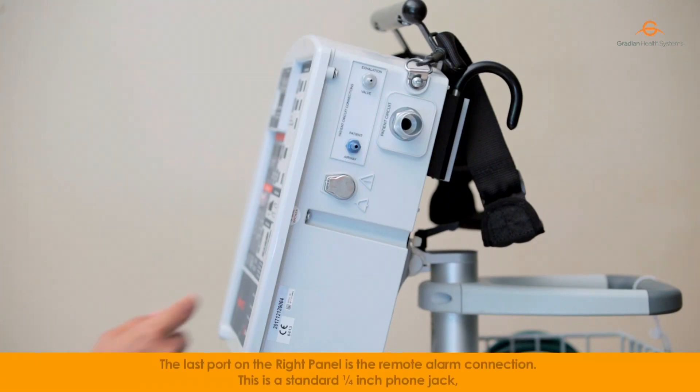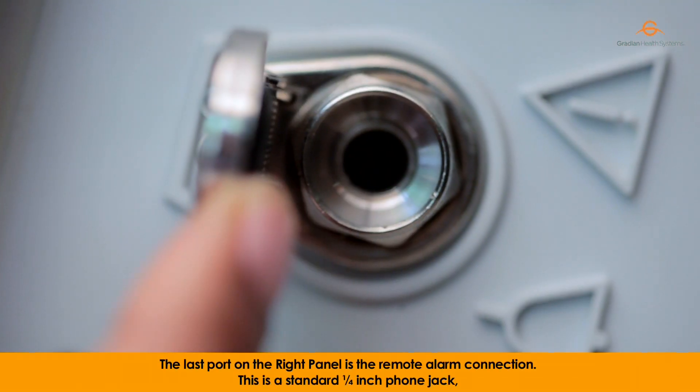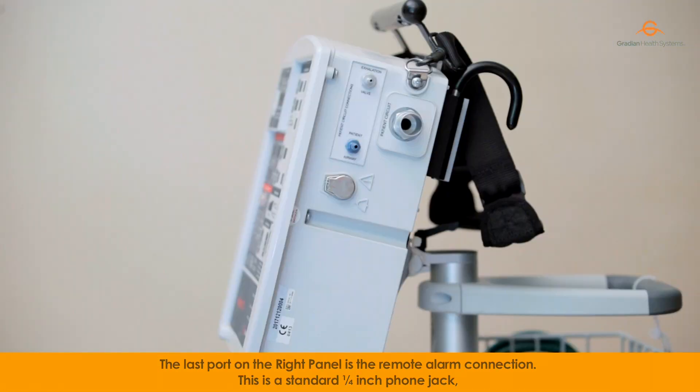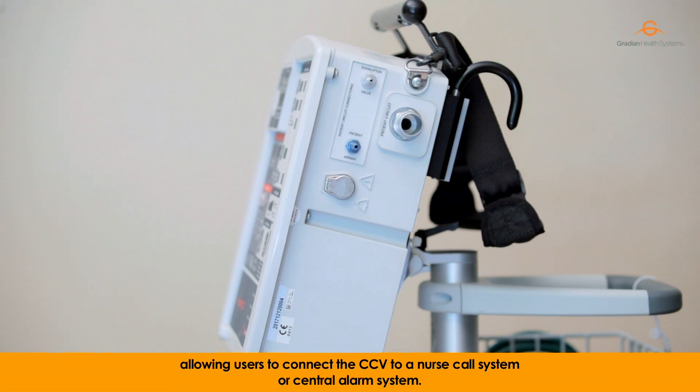The last port on the right panel is the remote alarm connection. This is a standard quarter-inch phone jack allowing users to connect the CCV to a nurse call system or a central alarm system.